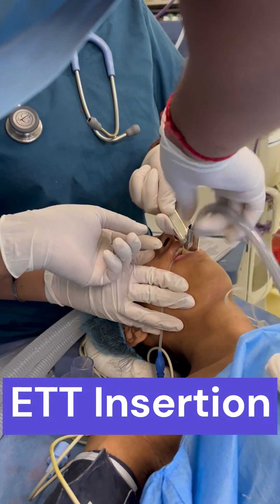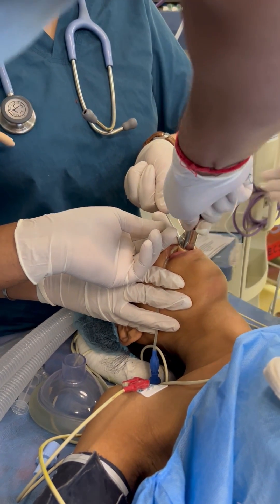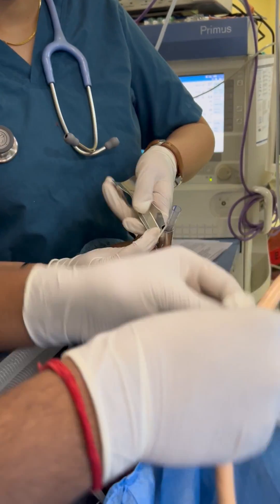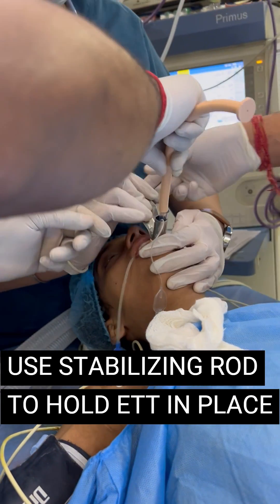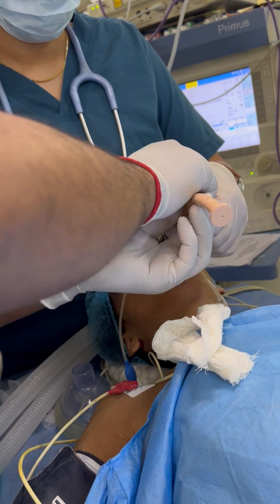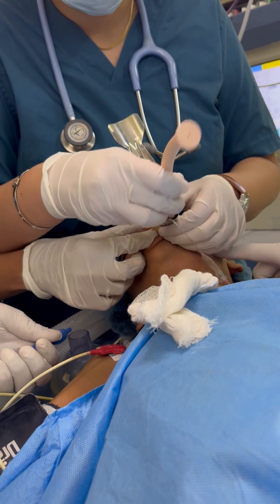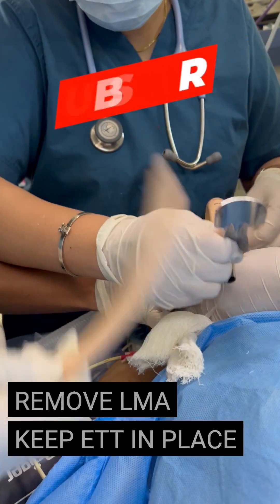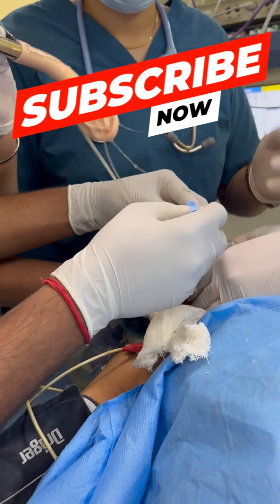Now the endotracheal tube is inserted through the LMA. This stabilizing rod is used to hold the ETT in place. Now remove the LMA gently, hold the ETT in place, and check for correct placement of the endotracheal tube.